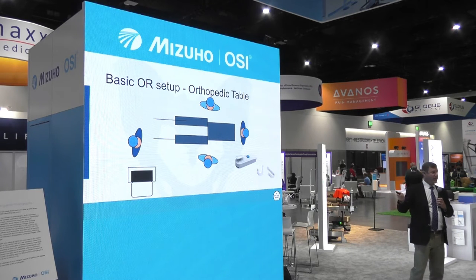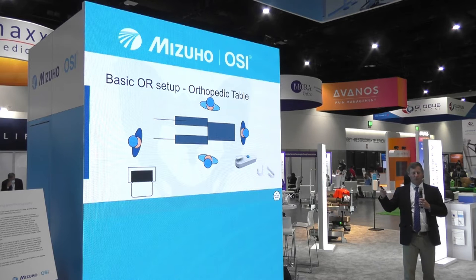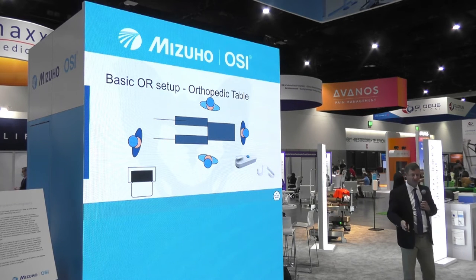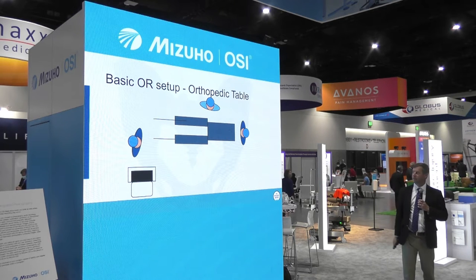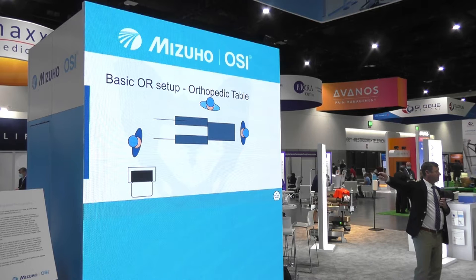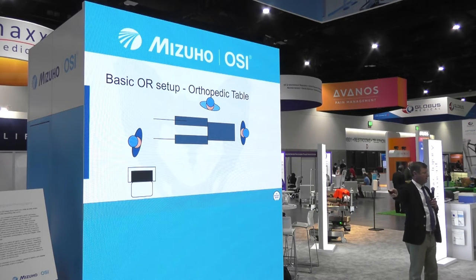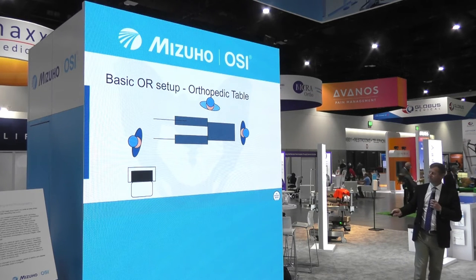But with the advent of additional assisted devices, such as self-retaining retractor systems, you can actually eliminate the person across the table. So now this person's gone. So now this is my current OR configuration. I have an anesthesiologist, I have a circulating nurse, and I have myself, and I have somebody to handle the instruments, but that's it. Nobody else touching the patient.